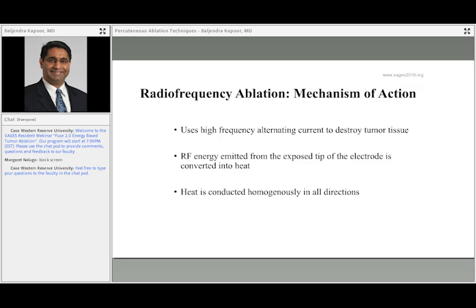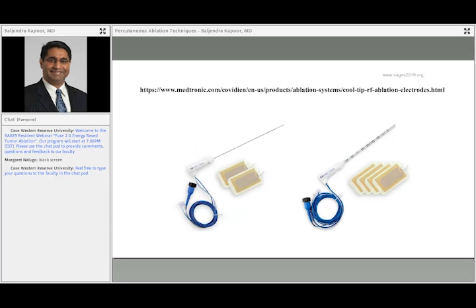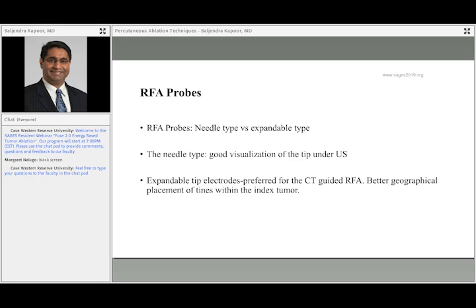Now, radio frequency ablation, we already talked about the mechanism of action. It uses high frequency alternating current to destroy the tumor tissue, and the RF energy that's emitted from the exposed tip of the electrode is converted into heat, and heat is then ideally distributed homogeneously in all directions. This is just a picture I brought. That's the Medtronic ablation system that we use. And these are the different kinds of probes that are available in the market.